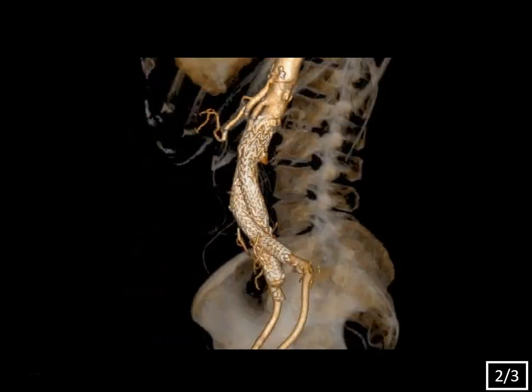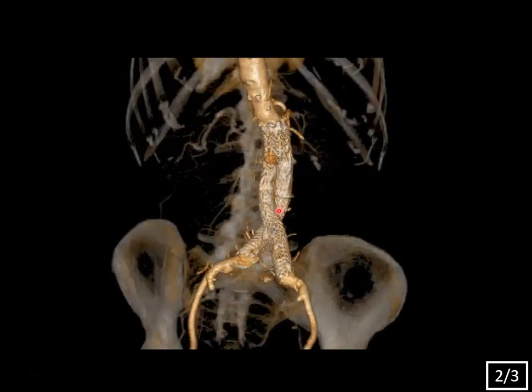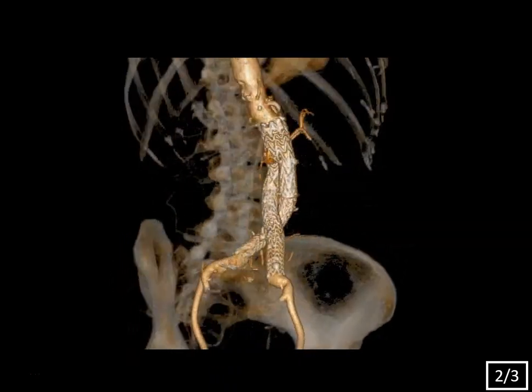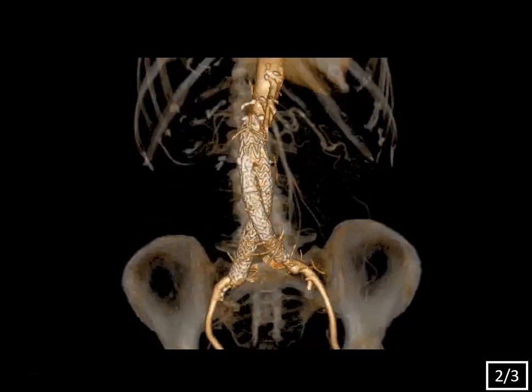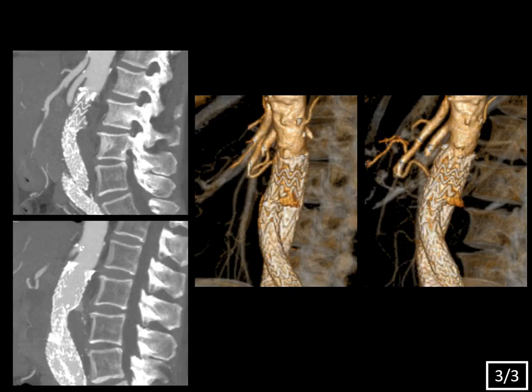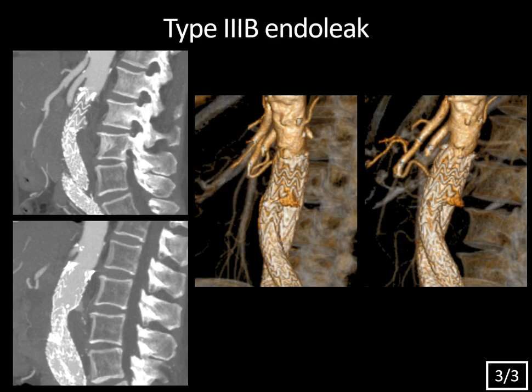Looking at the rotating 3D volume rendered image of the graft, the modular components appear intact — no detachment of that pant leg like in the last case. However, notice the splaying of the graft mesh apart. There's a focal defect in the graft with contrast focally extending through this hole. The sagittal reformatted MIP images show that focal splaying apart of the mesh work and contrast extending out of that defect into the excluded aneurysm sac. The 3D volume rendered images show the defect even better. So what type of endoleak is this? Yes — type 3b endoleak.